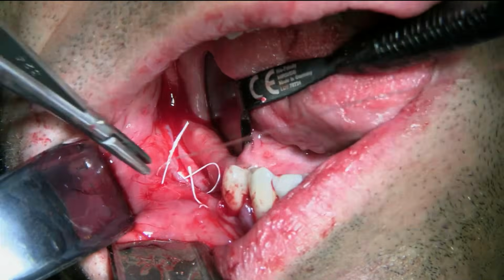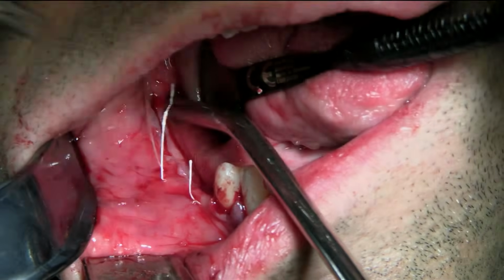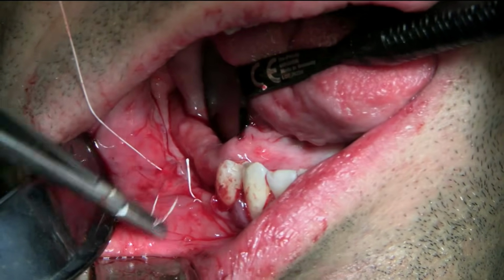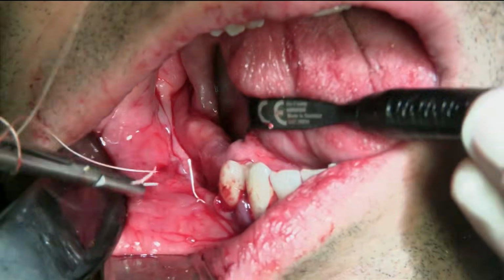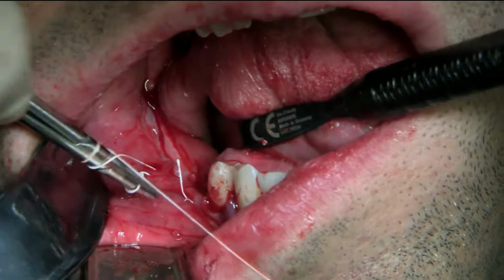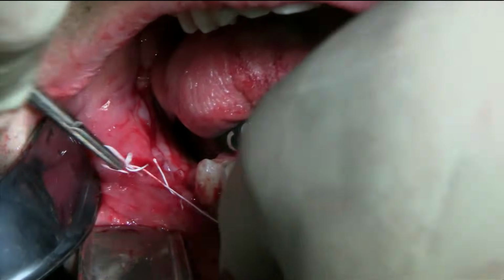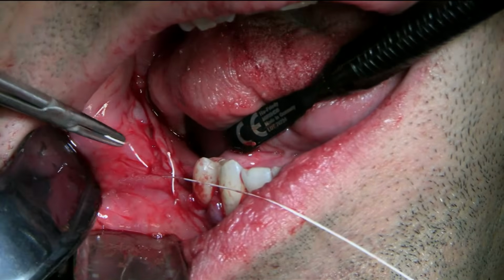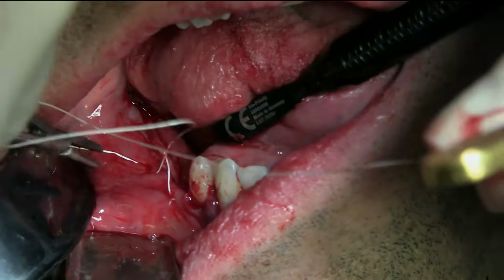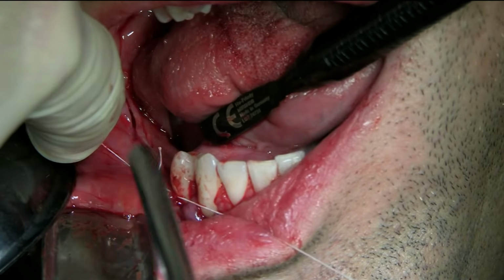Okay. Here we go. You can see my suture is completely in mucosa because I have no keratinized tissue. But the flap is nice and thick. So look, now it's everting. You just saw it pop. I saw it on the video too. Yeah?